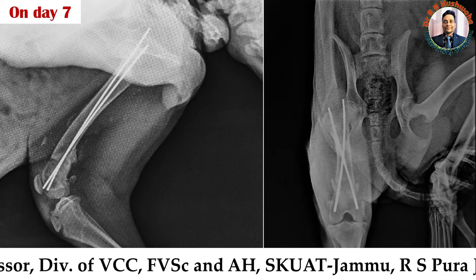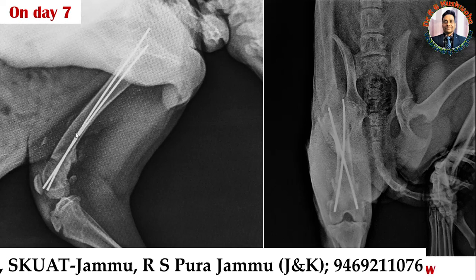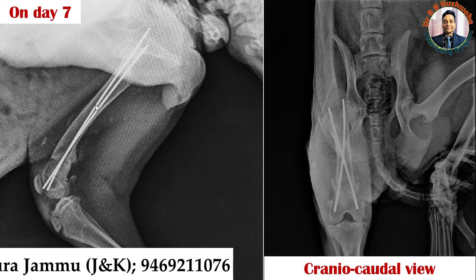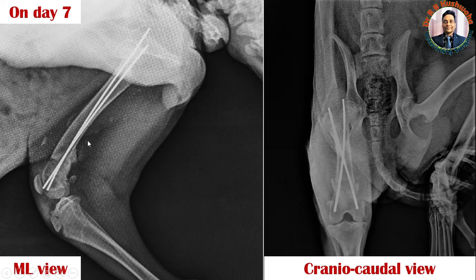This is the mediolateral view and the craniocaudal view of the same animal on day seven. If you see on day seven, the two K-wires remain in position — there is no migration either proximally or distally, and the alignment is also very good. You could see the cranial cortical alignment and the posterior alignment, and comparing with the day zero radiograph, callus formation has started.